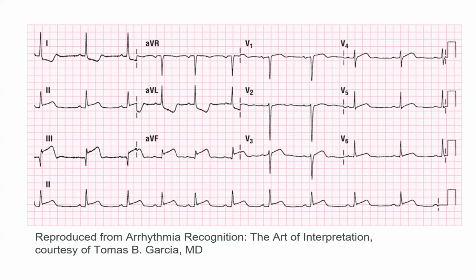All right, I got a few questions. Brayden, you had a question? I did, yeah, I'm sorry. Do you know it's an inferior because the inferior leads are the ones elevated? Yes. Okay.